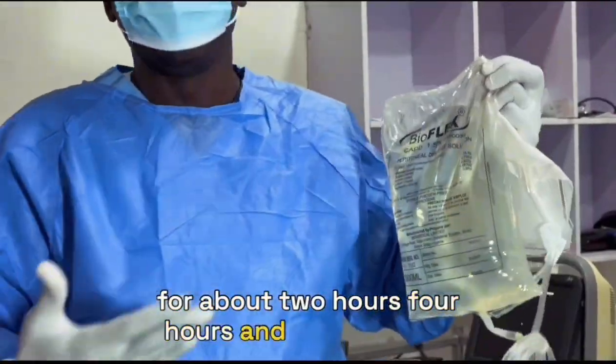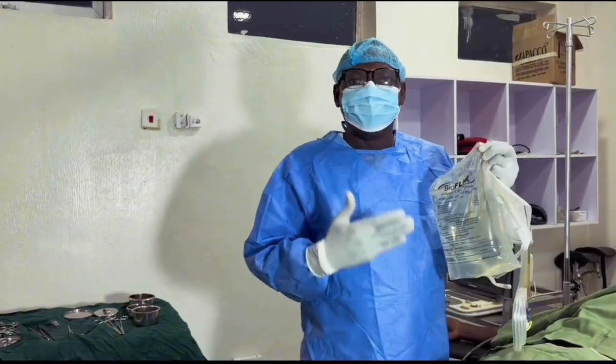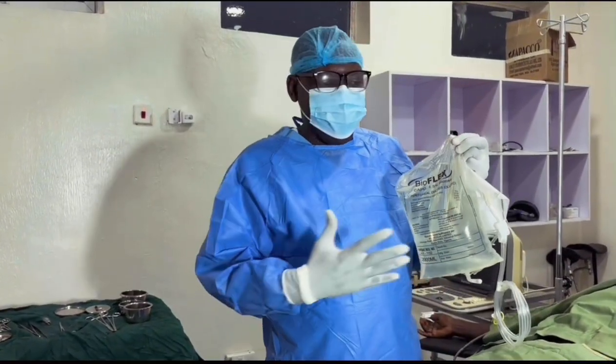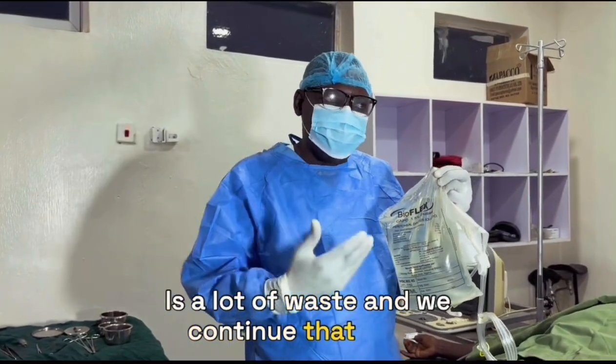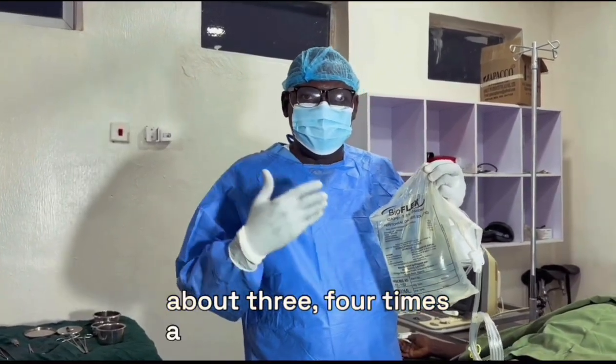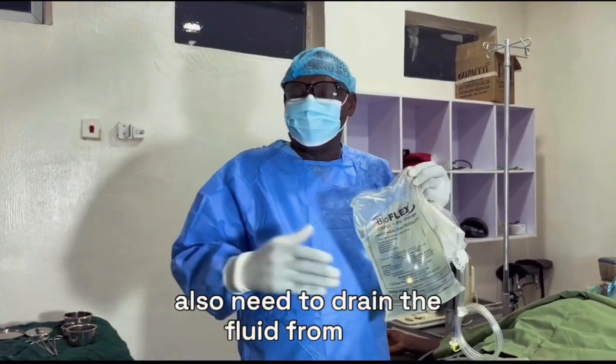So when we put it into the peritoneal cavity, the patient carries it about, goes about with it for about 2 hours, 4 hours, and after that we drain the fluid. After draining, that will come out with a lot of waste, and we continue that cycle about 3-4 times a day, and overnight we also leave the fluid to be in the peritoneal cavity.